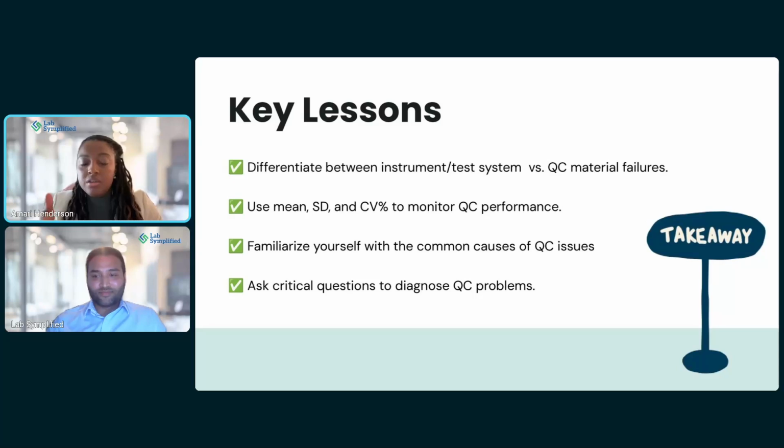There could be a certain analyte that's known for imprecision. Like I said, there's certain analytes that are more sensitive. So you want to go back to your assay instructions for use, and it will have data charts in the instructions for use. Usually you have to go pages into the instructions for use to find it, but it'll list out acceptable CV values, and you'll know for that particular assay what's considered acceptable. But a key overall value that you want to look at is usually like 10%. If you notice a CV over 10%, that is alarming to me.